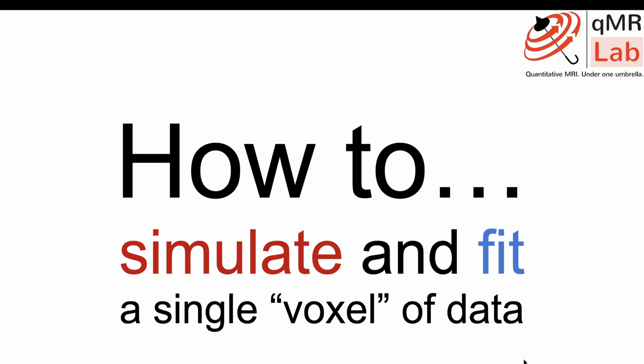So for this talk, I thought I'd give you the workflow that I would recommend for a brand new user that might not be familiar with qMRLab, and that might be doing quantitative MT for the first time. Before you dive into fitting a data set and looking at the results, it's important to understand what you're looking at, and whether the data was acquired correctly or if there might be some errors.